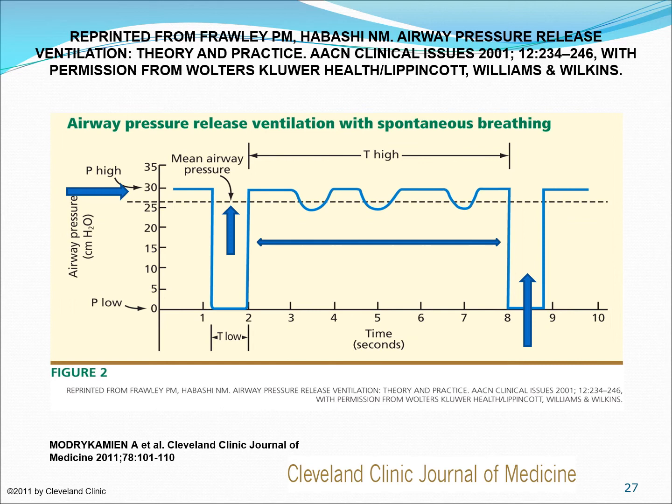And then your T low is typically 0.6 to 1 second. And what's the purpose of T low? That is for you to exhale gas. So what happens is the patient starts at this high pressure of plateau, which is your P high. They exhale right here, and then they're back to the high level, and then on top of this, they're breathing. See them breathing? Spontaneously breathing. The little dips, they're spontaneously breathing, and then they exhale again. And then they come back and they do the whole thing over again.